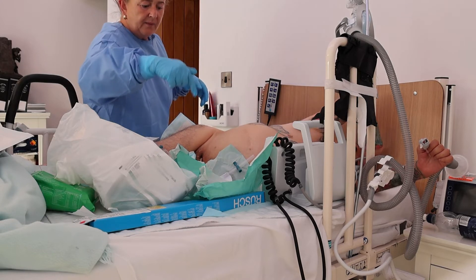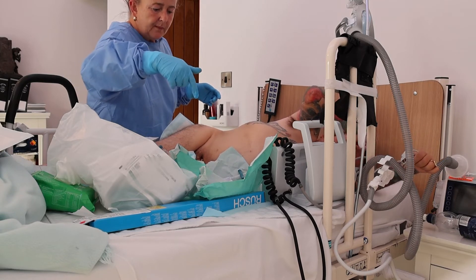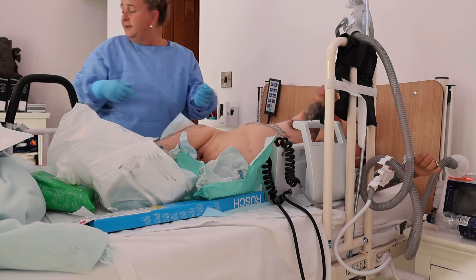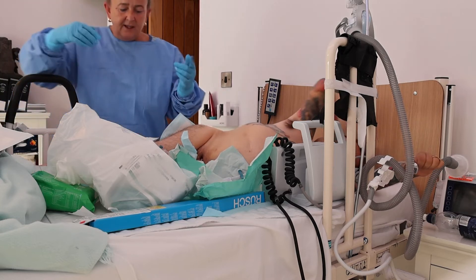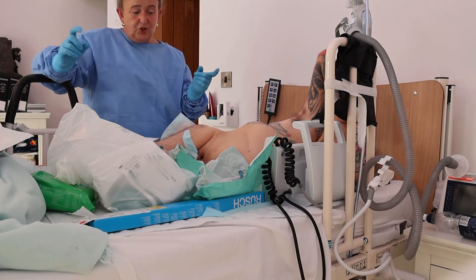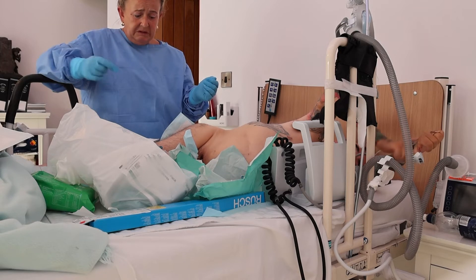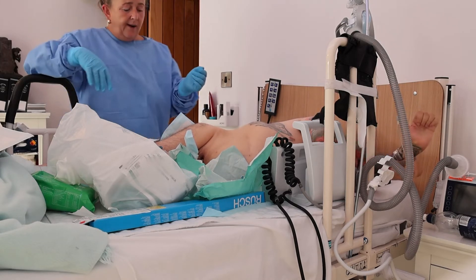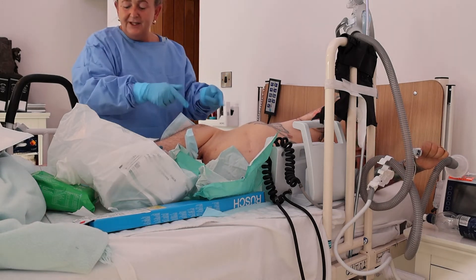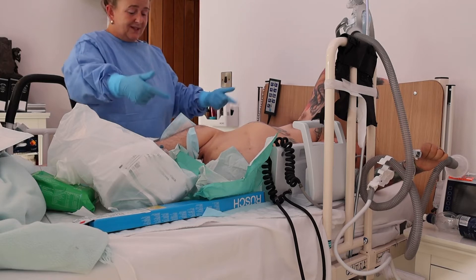In here I have the size of the catheter going back in, and I have instillagel ready. It's gone down to 127, so I'm going to go straight in now. Everything has to be sterilized. This is his first catheter change, so the catheter itself is new. The other day when I reinserted it the channel went in perfectly. Today there's just an issue and he doesn't want to be doubly incontinent — this is the only way forward, otherwise we'd have to stay in.